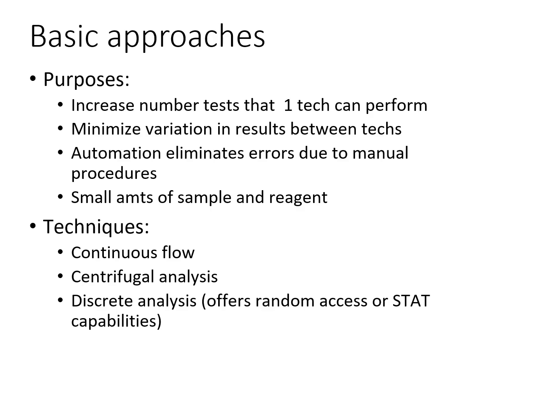And then we move on to the discrete analysis, where samples are processed individually in separate reaction chambers or wells. This enables random access testing where any test can be performed on any sample at any time without having to wait for the batch to be done processing. It supports stat testing, which is an urgent test with a faster turnaround. And this approach is now standard in modern analyzers.